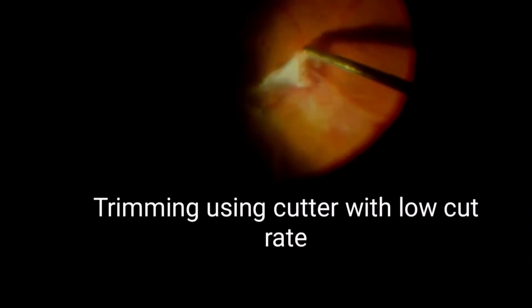The cutter was used to trim the flower at low cut rate and vacuum. The stalk was vascular and bled. We identified a second flat membrane along the superior arcades that was causing traction on the underlying retina.